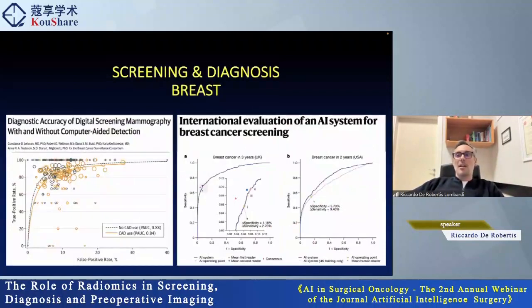Another important field in which screening has a fundamental role is breast cancer. Mammography screening has a very old history. In mammographic screening, of course, it is critical to have a high accuracy because false positives will lead to unnecessary intervention while, and this is more important, false negatives will lead to cancer progression. Because of the long history of mammographic screening, there are very large repositories of mammographic images, so they were used to develop a computer-aided diagnostic workstation to aid in the interpretation of mammographic images.